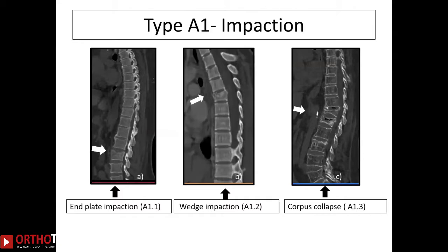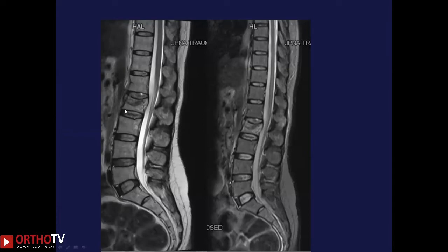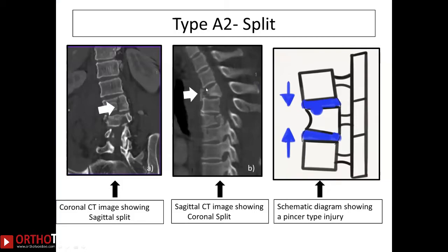The typical compression fracture caused by flexion has a hallmark: only the anterior part of the vertebral body is involved and the posterior vertebral body wall remains intact. This is seen beautifully on MRI — only the anterior part of the vertebra is compressed, the posterior part of the vertebral body is intact, and the dark band of the PLC — the supraspinous ligament, ligamentum flavum, and interspinous ligament — are all intact. The same picture is seen on STIR images, confirming the PLC is intact.